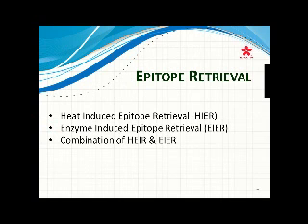Now that we've covered our general immunology, we're going to start getting into the process of detection systems and also epitope retrieval and how this reaction starts happening. So we know what the antigen is, we know what an antibody is, and we have an idea of what primary and secondary antibodies are.